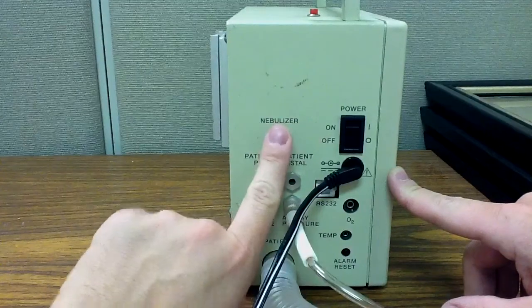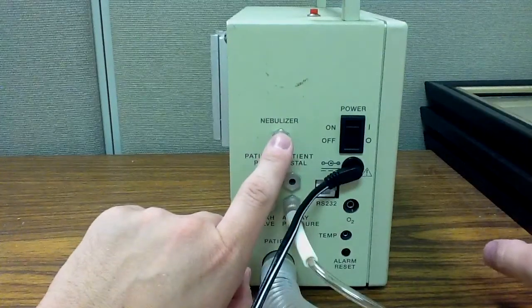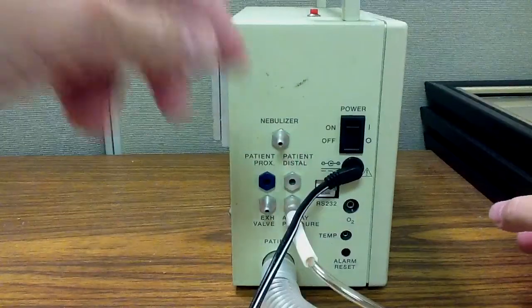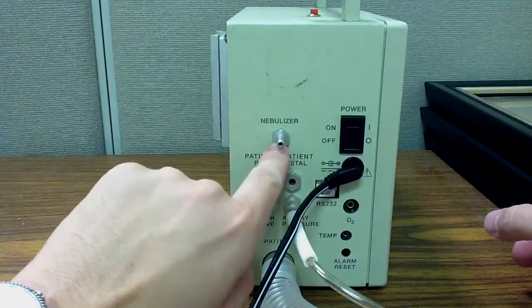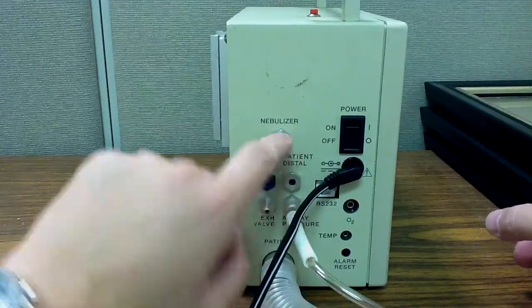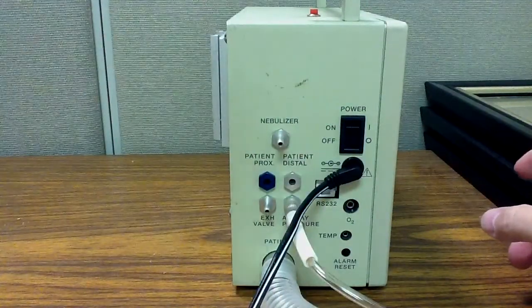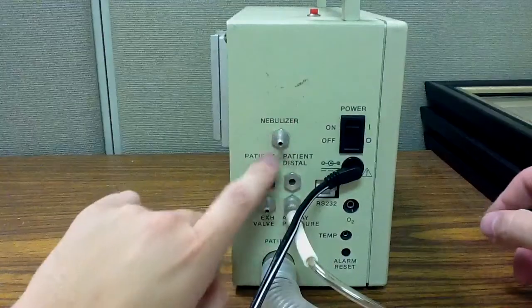Hook your nebulizer in line and instead of attaching the nebulizer tubing to the ventilator, you attach it to an oxygen source and you turn it on 8 liters a minute.